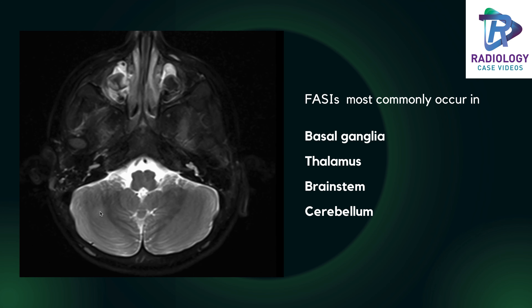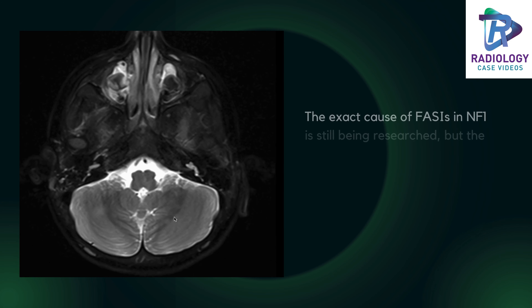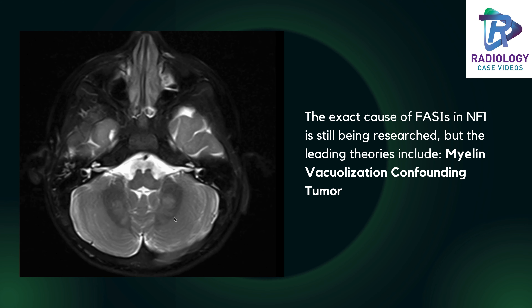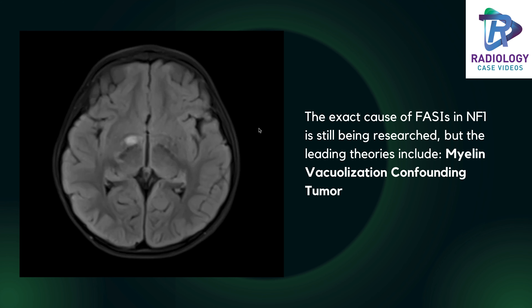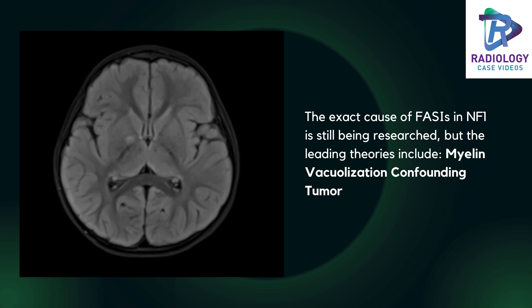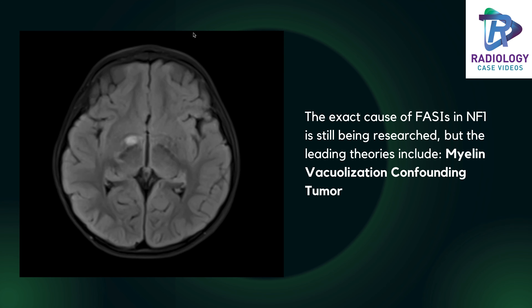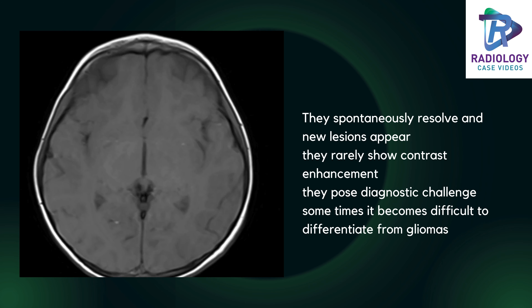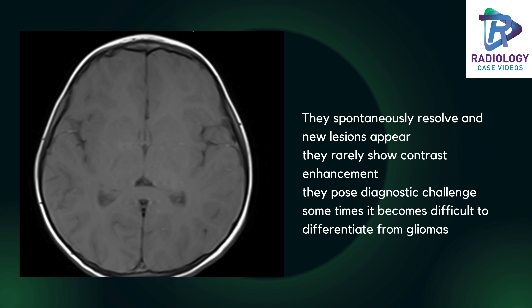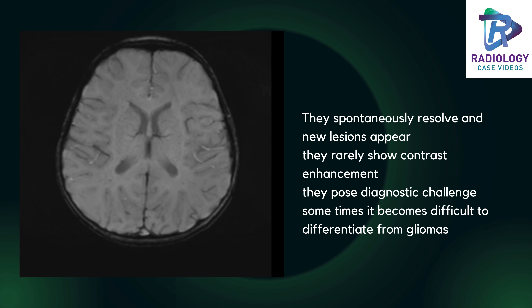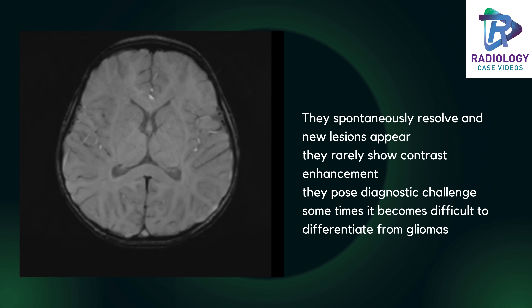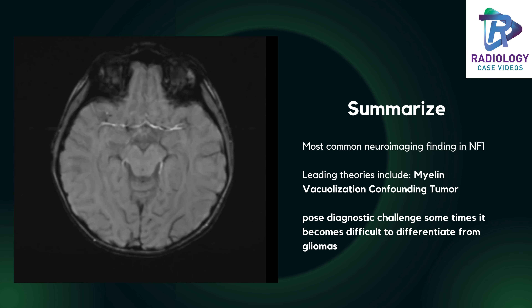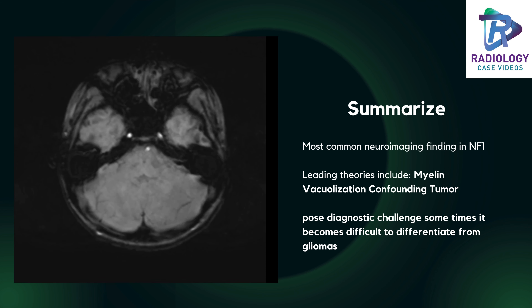And also in the right inferior cerebellum. These are nothing but foci of abnormal signal intensities, typically seen in cases with neurofibromatosis. These lesions sometimes disappear and are mostly due to myelin vacuolization. There is no blooming on SWI. Thank you very much — hope this case discussion was useful for you.